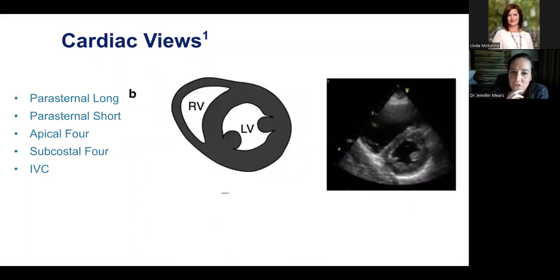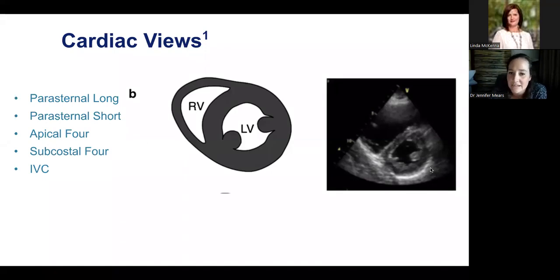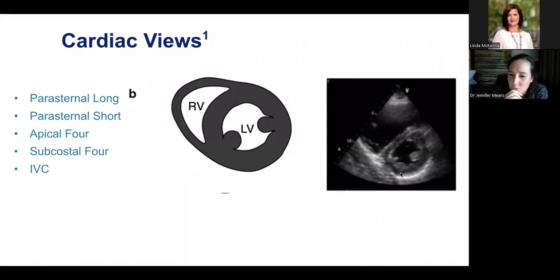The parasternal short is a 90-degree view change from the parasternal long — you rotate the probe with the indicator now facing the left shoulder, giving a cross-section of both ventricles. The left ventricle is the higher pressure system with a thicker muscular wall, and the right ventricle hugs around it. The left ventricle almost always has a circumferential shape. Certain pathologies where the right ventricle is under higher strain can start to flatten this wall. This view is also very good for identifying segmental wall movement abnormalities.